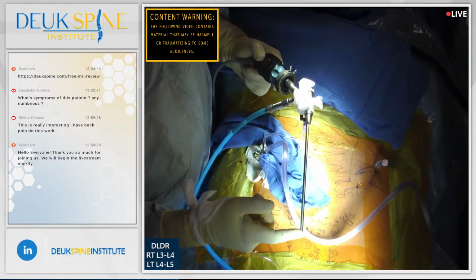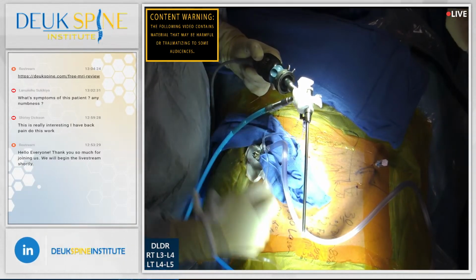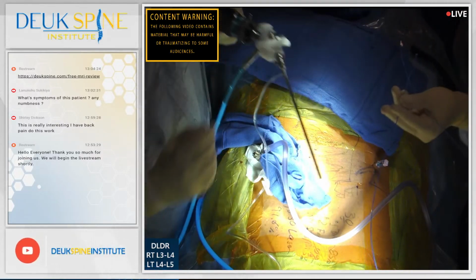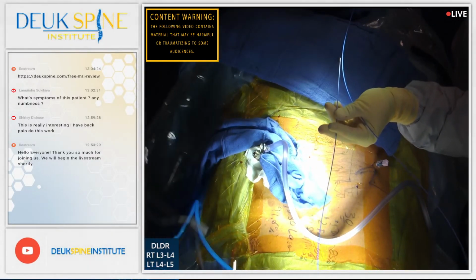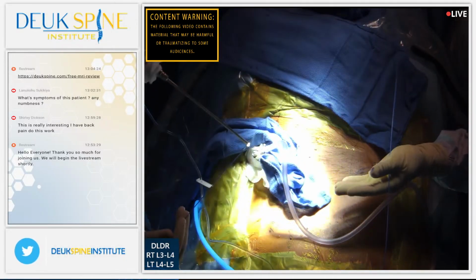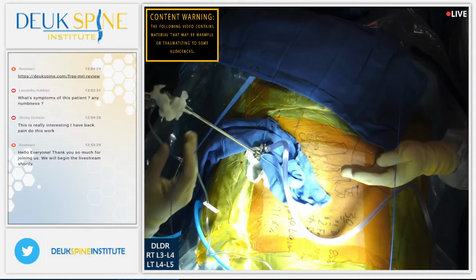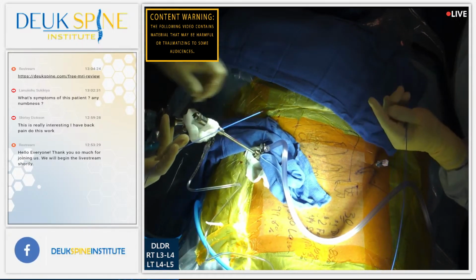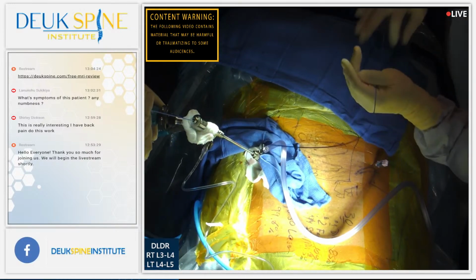And we have a little rod lens system that allows the image at the tip to be projected onto the camera. This is a high definition camera. It allows us to see what we're doing. The entire surgery is done with a 1 millimeter laser fiber, 1 millimeter. Super precise, super safe. Never had a complication in 20 years with using this laser fiber.